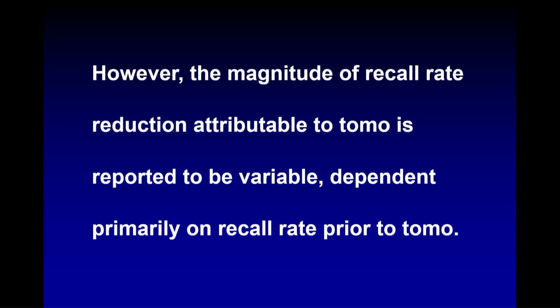Now, for those of you who have read our literature, you've seen that tomosynthesis reduces the recall rate by as much as 40%, which is true. If you carefully read these articles, you'll see that for some radiologists, it doesn't reduce the recall rate by much at all. Maybe only a few percent. That's a big difference. And the difference is, if you go back and carefully look at the literature, it depends on what your recall rate was before you started using tomo.